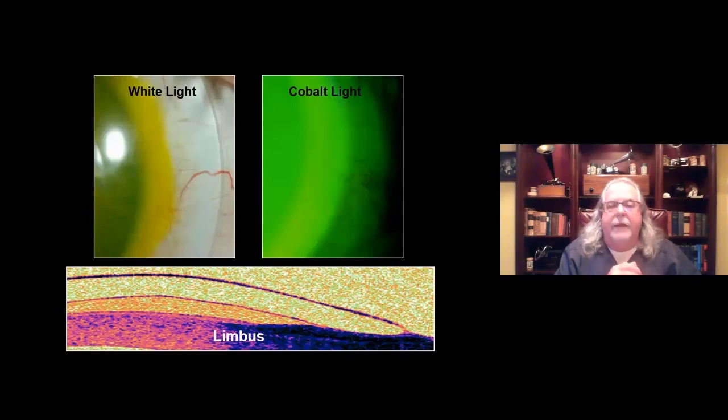This really then takes all the weight and bearing of the contact lens and places it on the scleral landing zone. So you can see here, we need a scleral lens that clears the central cornea, clears the peripheral cornea, clears the limbus, and then ultimately lands on the sclera, or better yet, on the bulbar conjunctiva at the periphery of the lens.